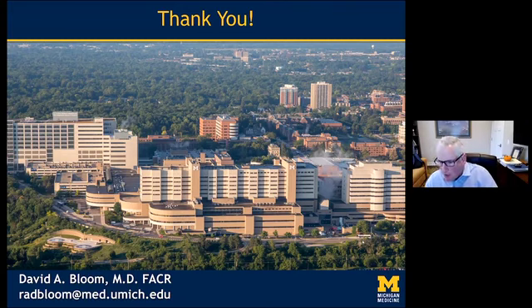Let's see here. Do you use hepatic MRI contrast in differentiating liver lesions at any pediatric age? Can we apply LI-RADS in pediatric HCC? So two great questions. Number one, we do use gadoxetate in liver tumor imaging. We especially use it in our screening of our chronic liver disease patients, such as the Fontan patients and other patients with history of primary sclerosing cholangitis or other related liver issues. So we do use it. We will use it in almost any age group.